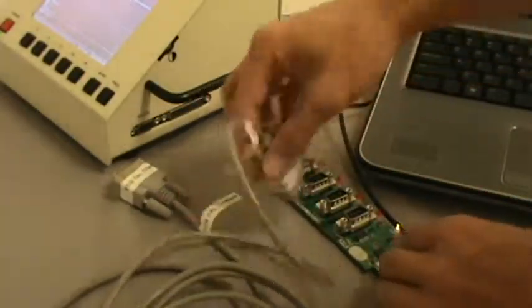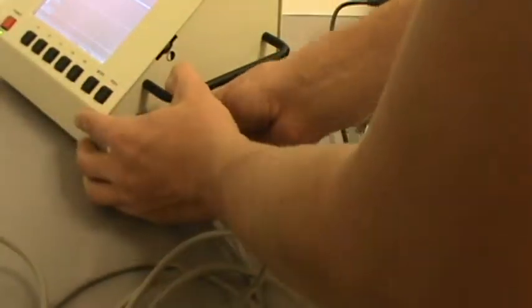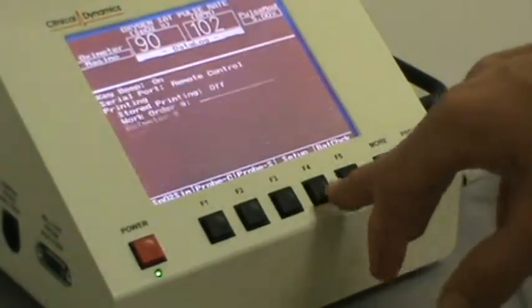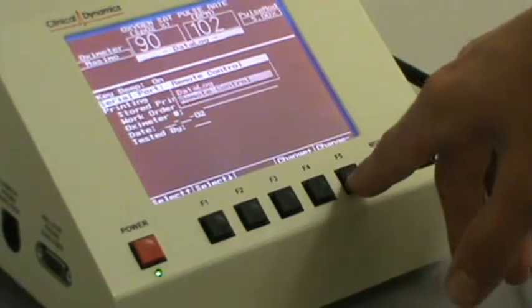All of these settings can also be controlled through the RS-232 port. In order to set this up, connect the SmartSat to a computer with an RS-232 cord. Then, on the SmartSat, select Setup and change the serial port to Remote Control.